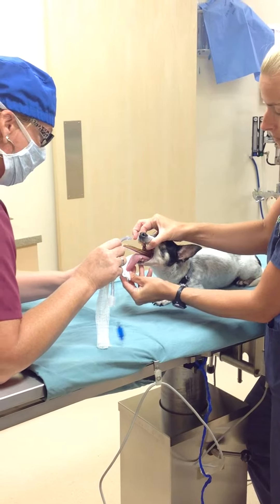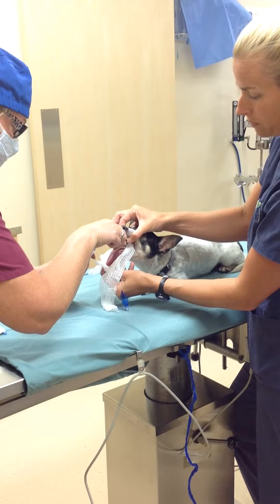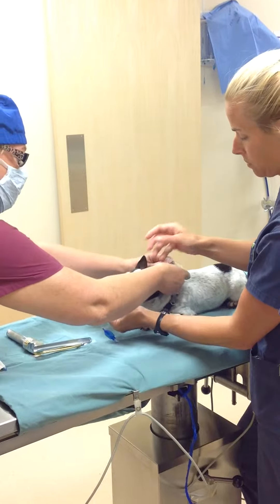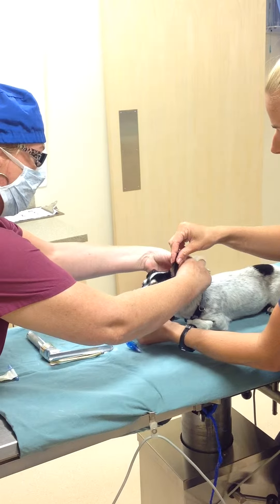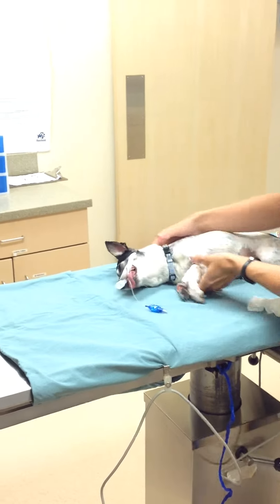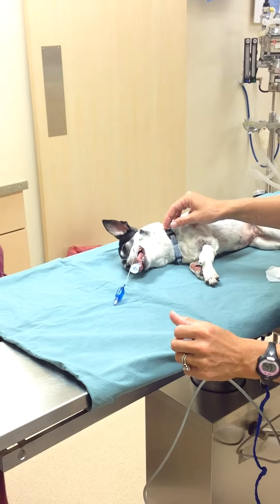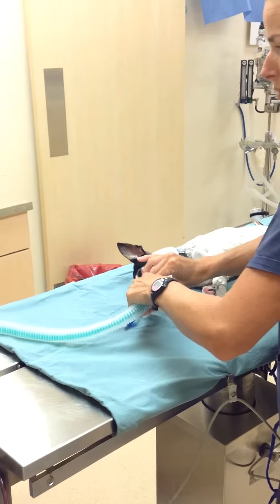Alright, starting. Tying the tube in place. Reinflated the cuff. Getting the dog on oxygen and iso.